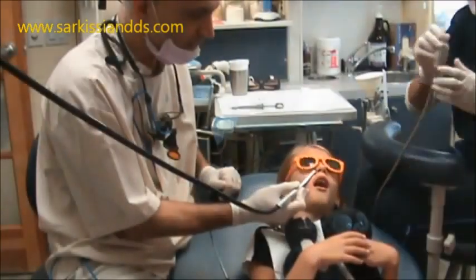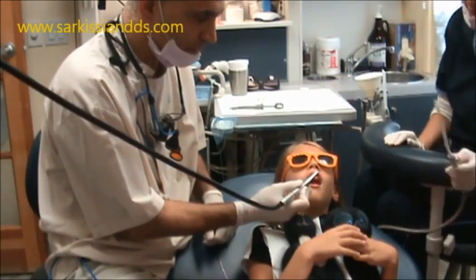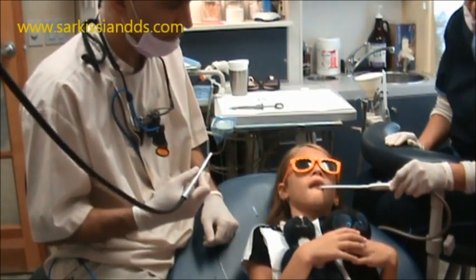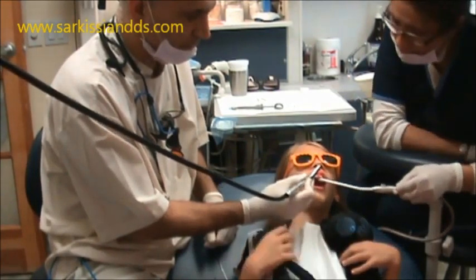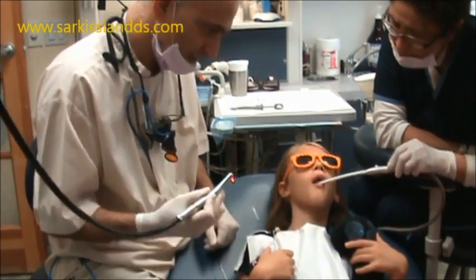Alright, shall we try again? It's just the water. Close your lips around it again. Close your lips. Alright, this is it. It's just like a tooth cleaning — very amazing. That's all we're going to do, okay? That's all.